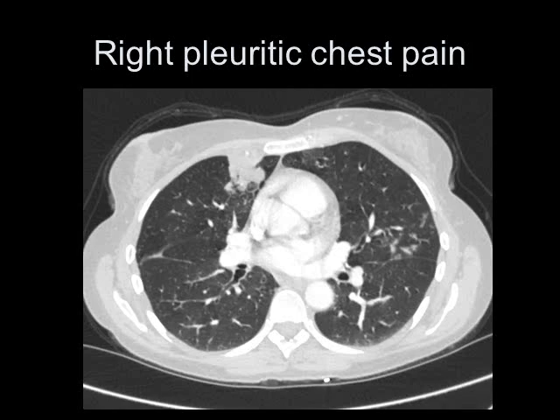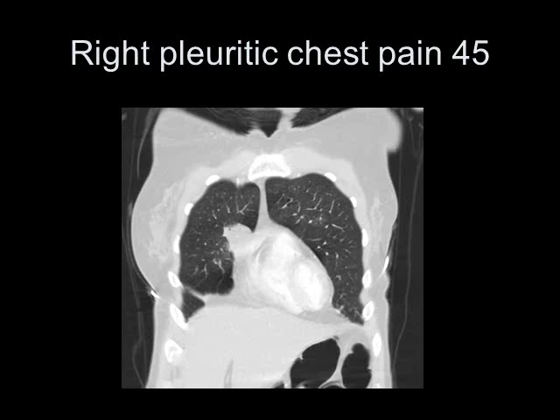Here's a patient with right pleuritic chest pain, an outpatient scanned because of a query tumor. You can see a wedge-shaped, volume-sparing area of opacification in keeping with consolidation, and on the coronal view the volume is maintained. This resolved after antibiotic treatment.